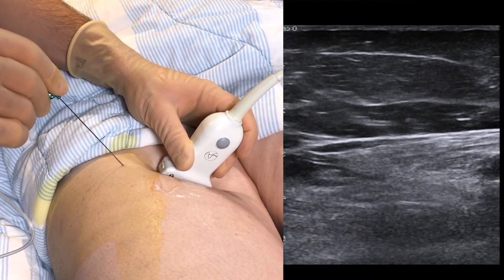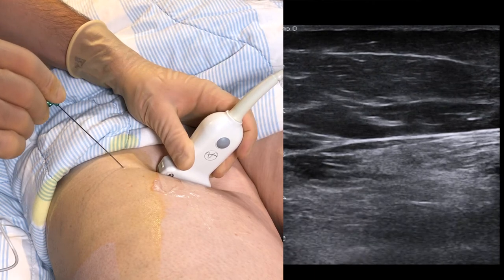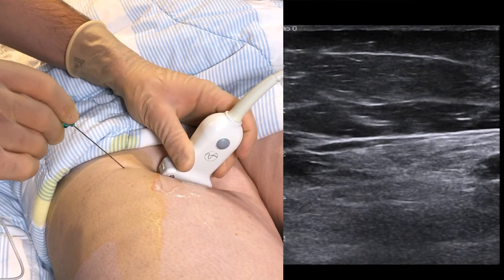Puncture the skin and place a small amount of local anesthetic just subcutaneously. Then proceed towards the artery, keeping the needle in plane at all times.